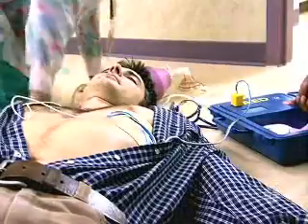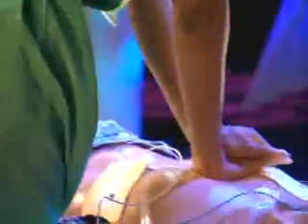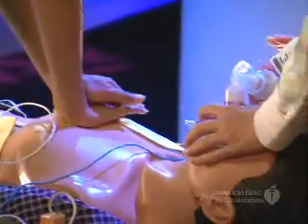I'm clear, you're clear. Clear. We're all clear. When the shock is delivered, the victim's muscles will jerk. The AED will then tell you to start CPR, beginning with chest compressions. Begin CPR.